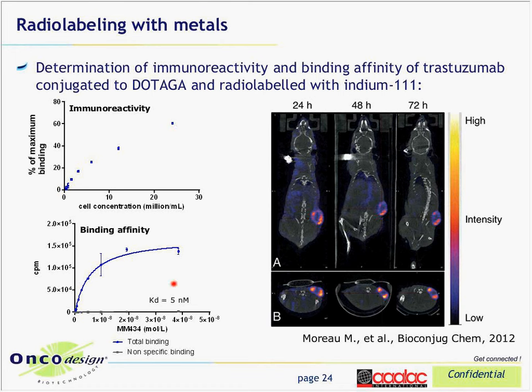We also checked the affinity, which was found to be close to 5 nanomolar, which was suitable for an in vivo experiment. And you have here the SPECT images recorded from 24 to 72 hours post injection. And you have here the display with a low background in organs.